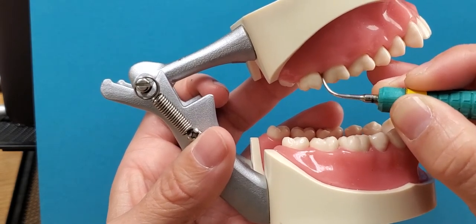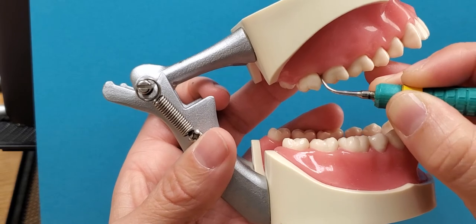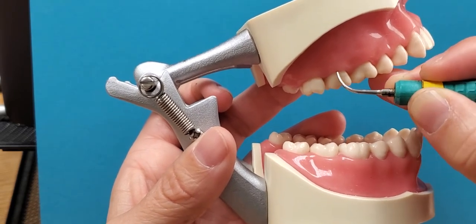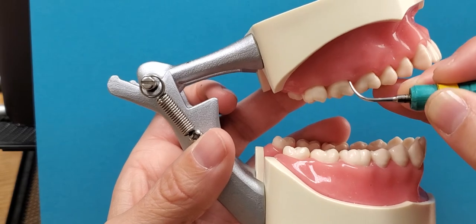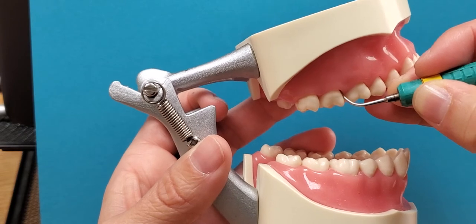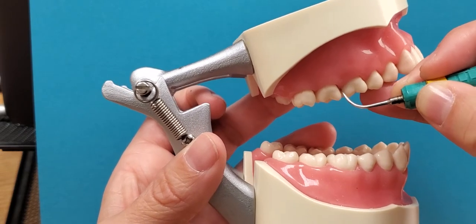In the interproximal spaces you're going to use a tapping motion. You want to tilt into that col space. We use a sweeping motion across the straight buccal, straight lingual depending on where you're at, and then tapping motion again into that mesial contact space.